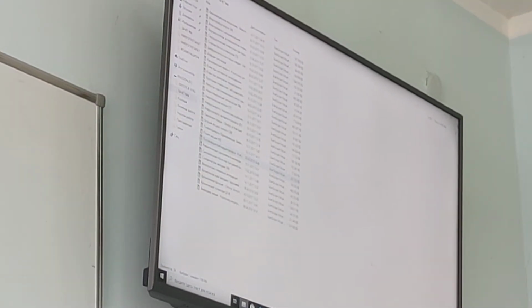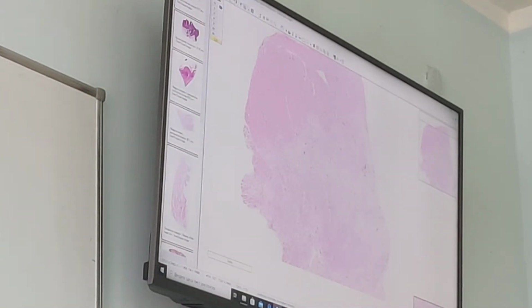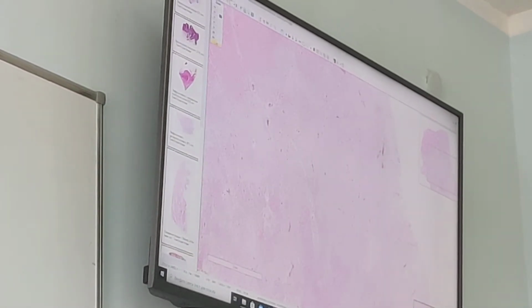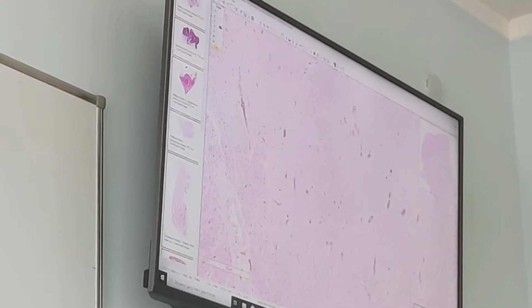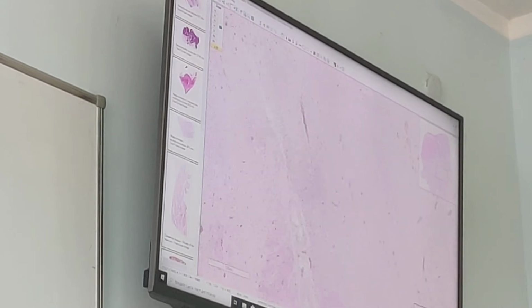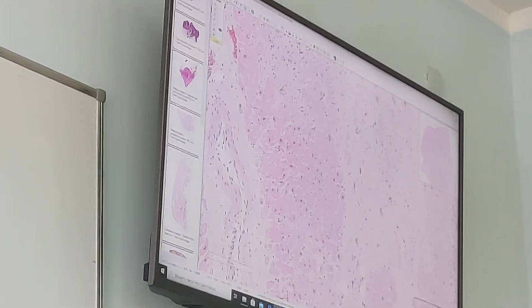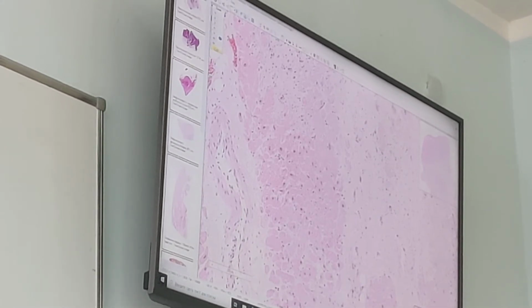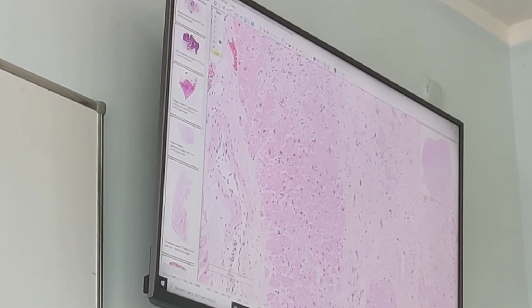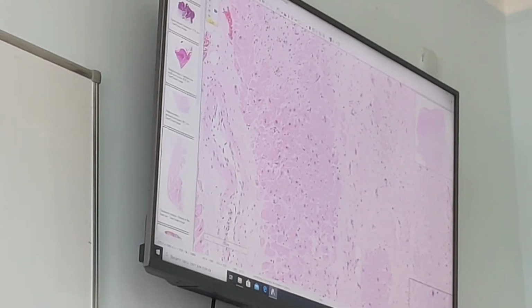Post-infarction cardiosclerosis. Simple preparation, just two main features can be seen. It's a zone of sclerosis, growth of connective tissue. It has clear pink color. And in the border of the sclerotic area, we can detect hypertrophied cardiomyocytes, like compensatory reaction. Sizes of cells are increased, sizes of nuclei are also increased, nuclei become darker, hyperchromatic.